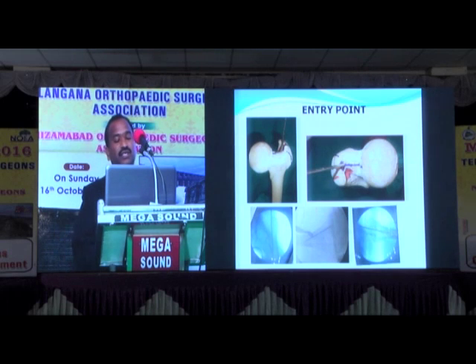The true lateral view is the most important to put the screws in the center of the head and neck, which is the most deciding part of the surgery.